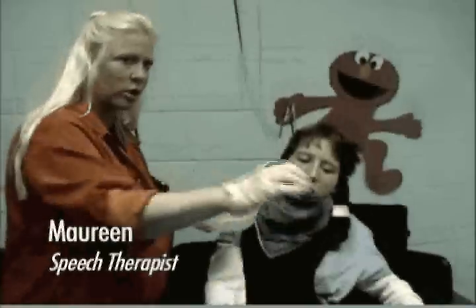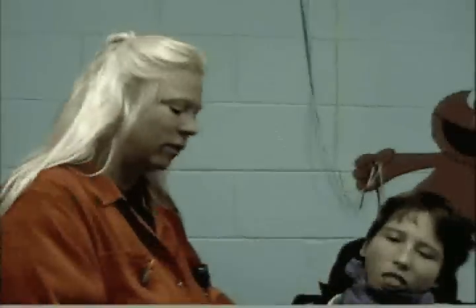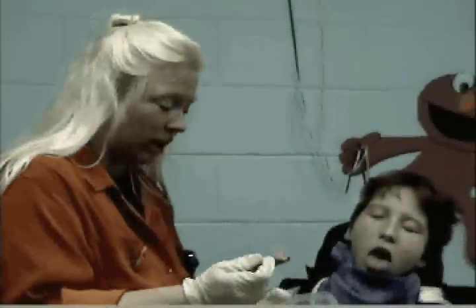Reach out and touch switches, reach out and help turn pages, reach out for objects and pictures — all those sorts of activities. Without that, she is just fighting and holding on, and I'm less able to do a whole lot of things with her.